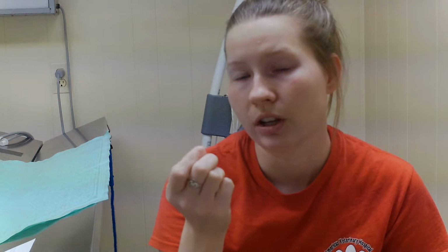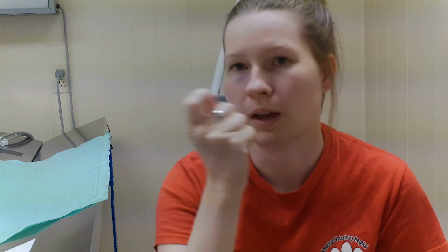Whenever I'm extubating my patients, and they do have a swallow reflex, I usually try to do it at least 3 times, pull on that tongue to stimulate a swallow reflex. I even try to push the endotracheal tube back and forth just a little bit, just to kind of tickle it. And you'll either hear them start coughing, and that's another indicator that they are waking up to extubate. But like I said, it'll also stimulate that swallowing reflex, and they'll try to push it out of their throat.